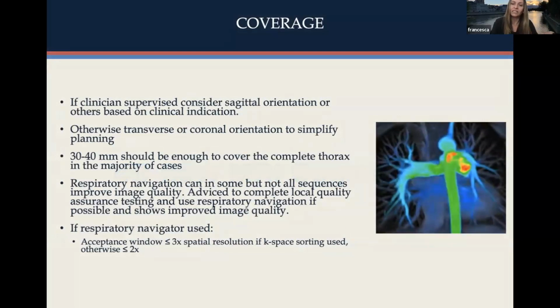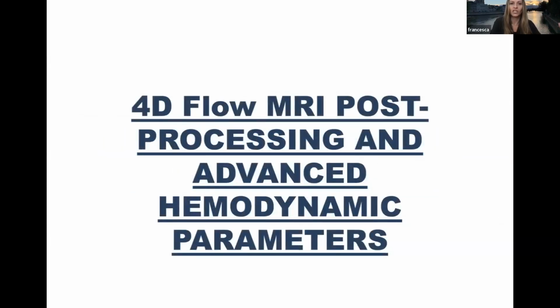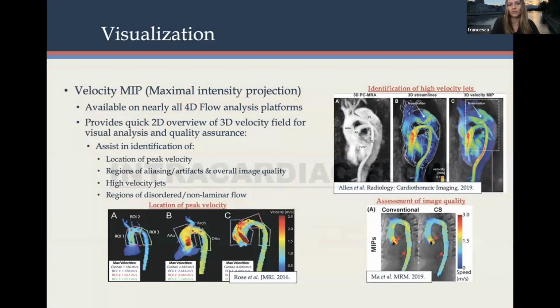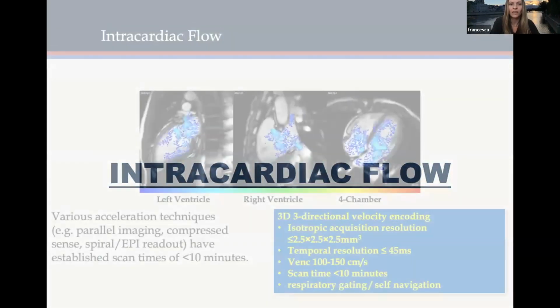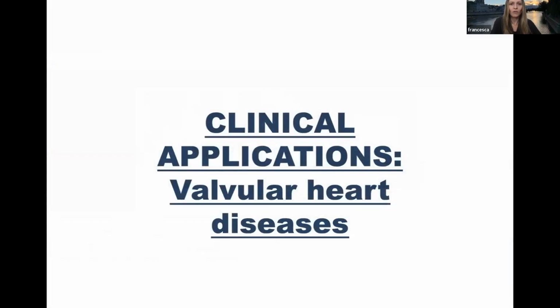But I really repeat that all this is just at the beginning of your activity. Then your sequence is done and you can use it, and your technician will not have much trouble. Then we suggest protocols for specific pathologies. We also suggest how to post-process and analyze advanced hemodynamic parameters, how to visualize and measure them, because it's really important that we measure a lot of parameters, for example, intracardiac flow. We really try to be synthetic in these PowerPoint slides.